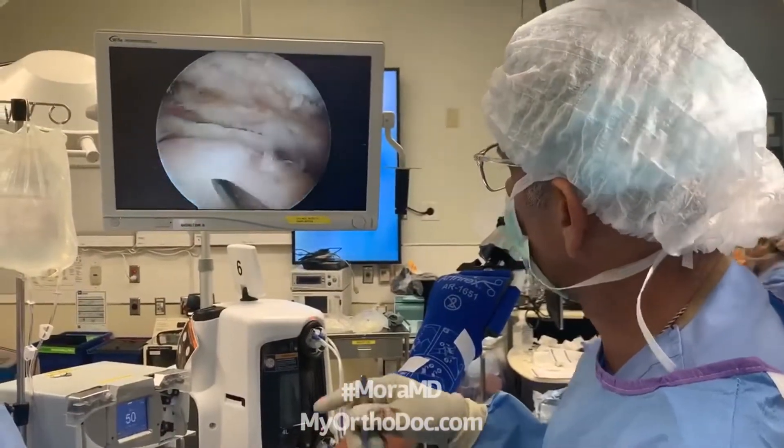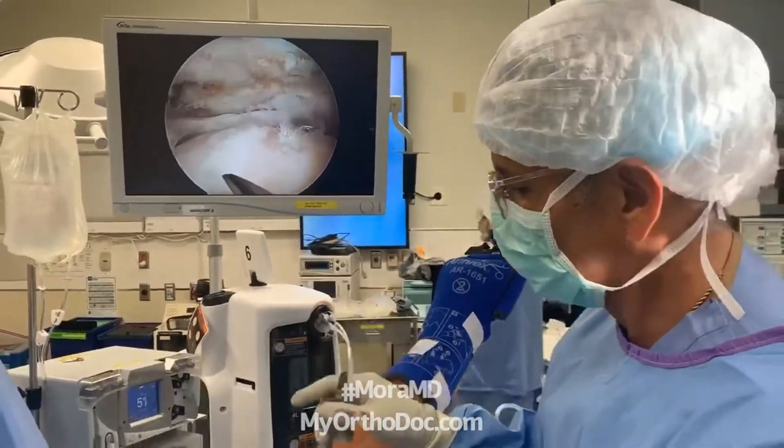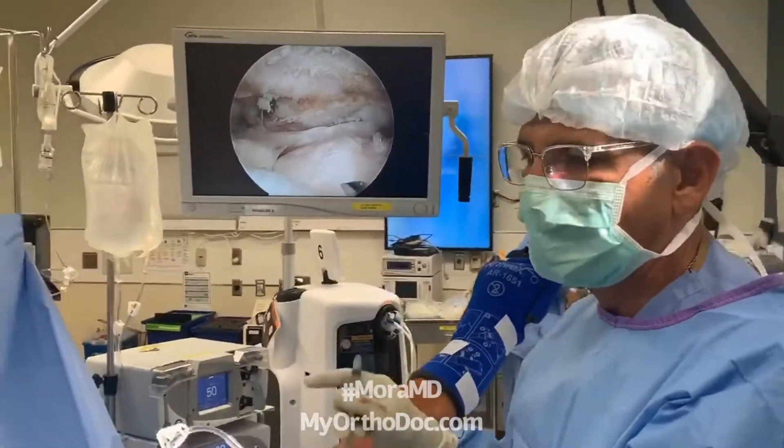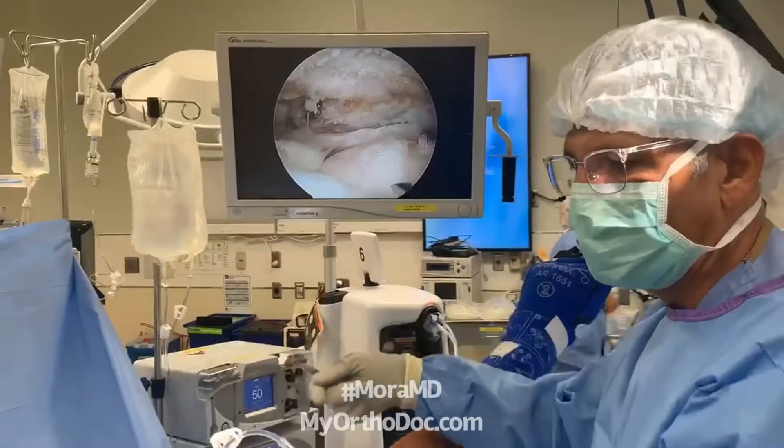What I'm going to do now is start to think about my repair strategy. Repair strategy means where I'm going to be putting anchors and how I'm going to be bringing the tendon back.